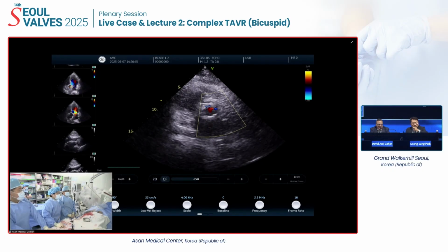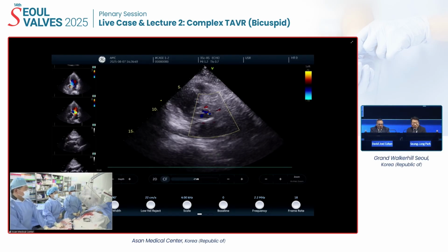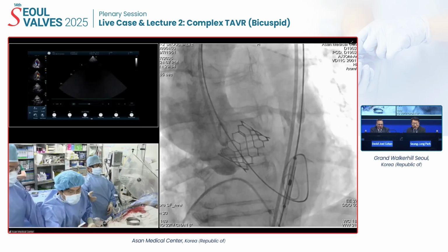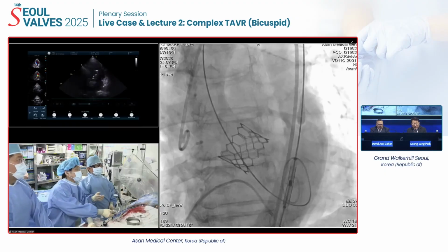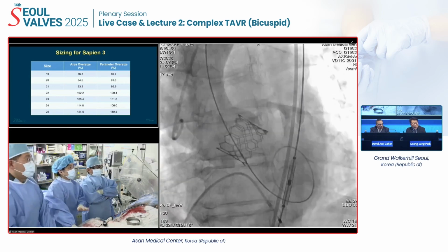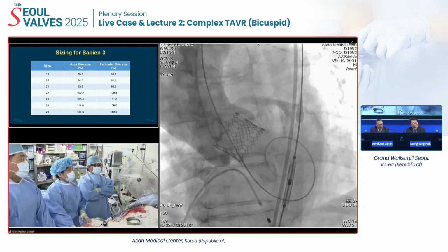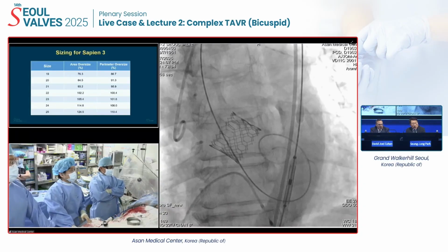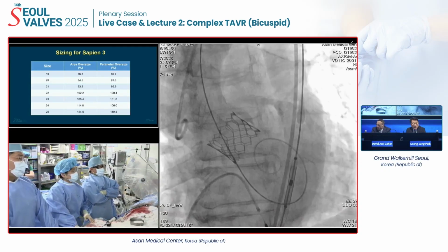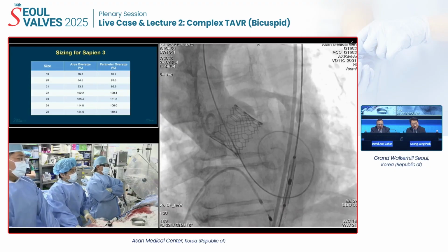Maybe 10 to 15% is fairly typical. Okay, would you show us the table for area oversizing 23? Dr. Ahn, I think it's maybe previous. We have some discussion point over there. 23 is a 5% oversizing. So we added 1 cc more. So around the 10% oversizing. Around the 10. Yeah. I think 10 seems very reasonable given very, very little calcium. Low calcium. And so I think that was a good choice.